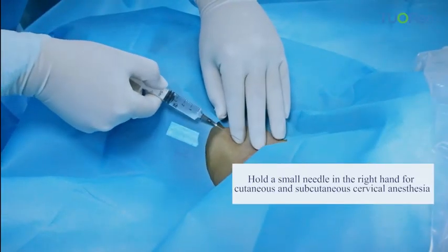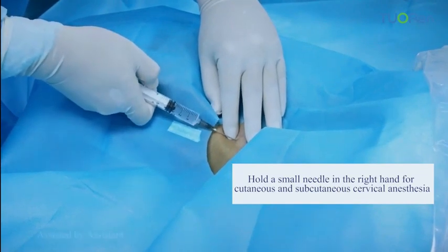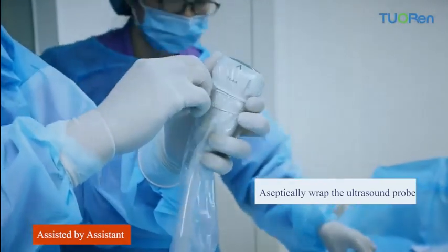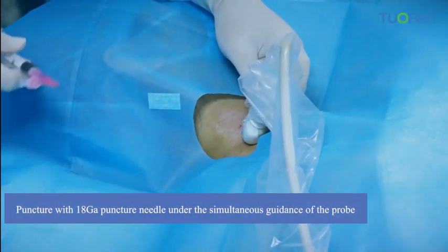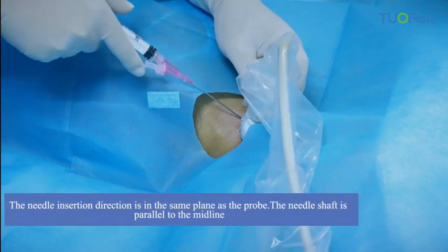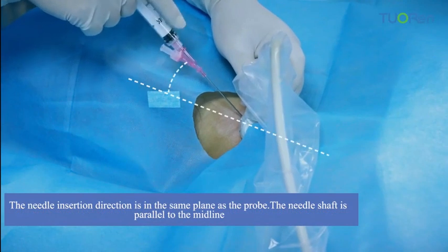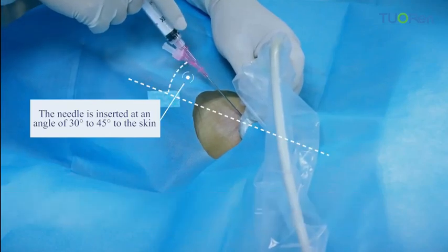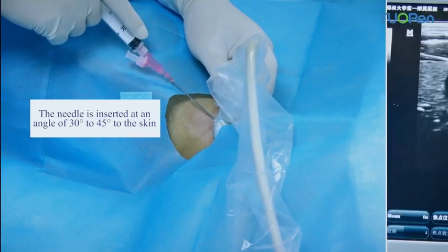Hold a small needle in the right hand for cutaneous and subcutaneous cervical anesthesia. Aseptically wrap the ultrasound probe. Puncture with the 18-gauge puncture needle under simultaneous guidance of the probe. The needle insertion direction is in the same plane as the probe. The needle shaft is parallel to the midline. The needle is inserted at an angle of 30 degrees to 45 degrees to the skin.